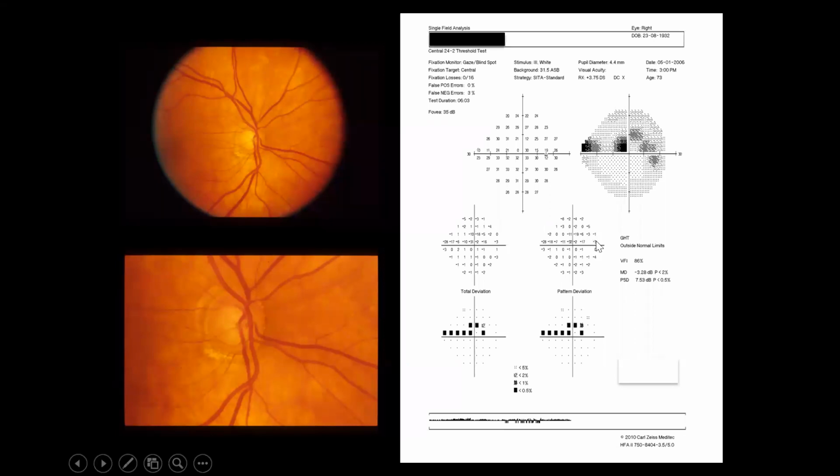So if you can see the arrow here, the blind spot, it's on your right hand, so that's the right visual field. You mentioned before the age, and the age is very important for us. Why is that? Because the software is comparing the patient's data to an age-matched normal population. So if you enter a wrong age, the machine will give us false data. Either the patient is departing significantly from the age-matched population, or the patient is matching an unrealistic age-matched population.